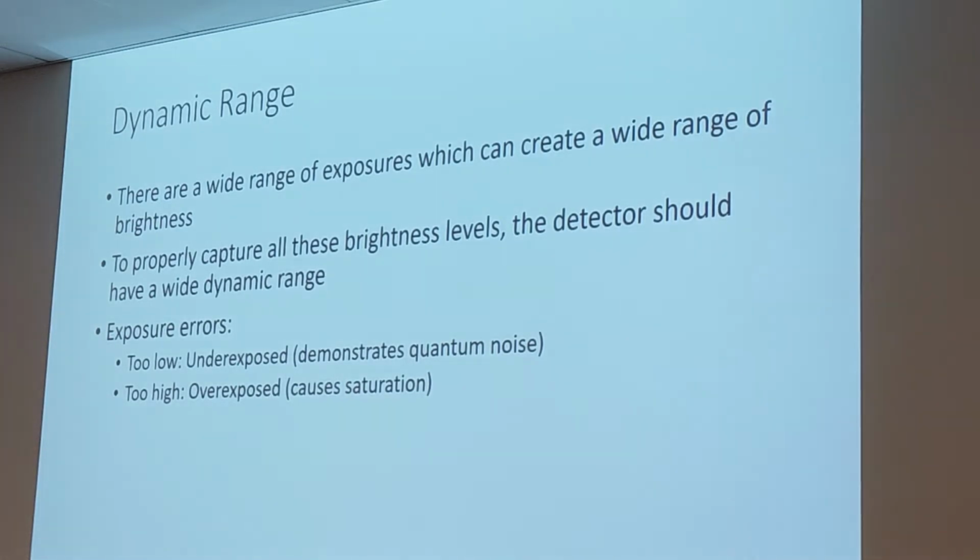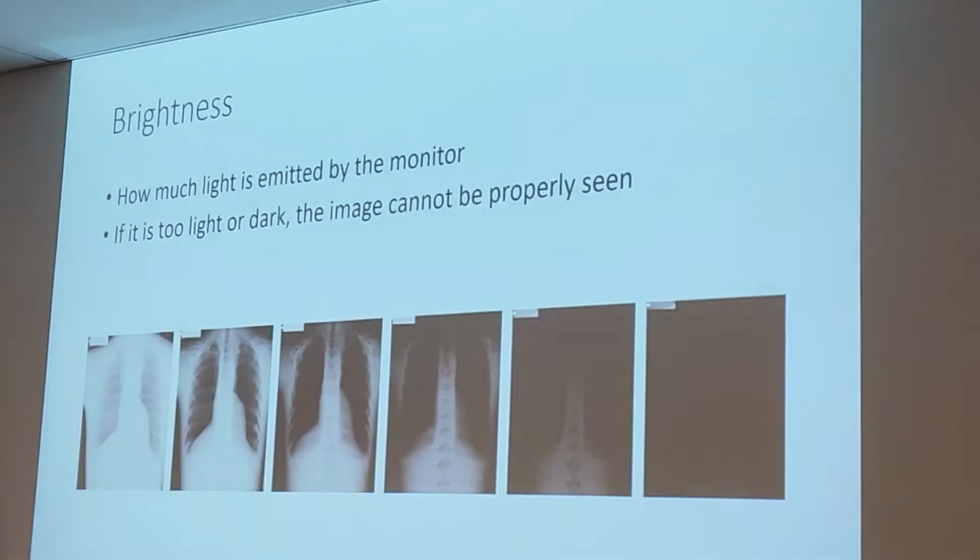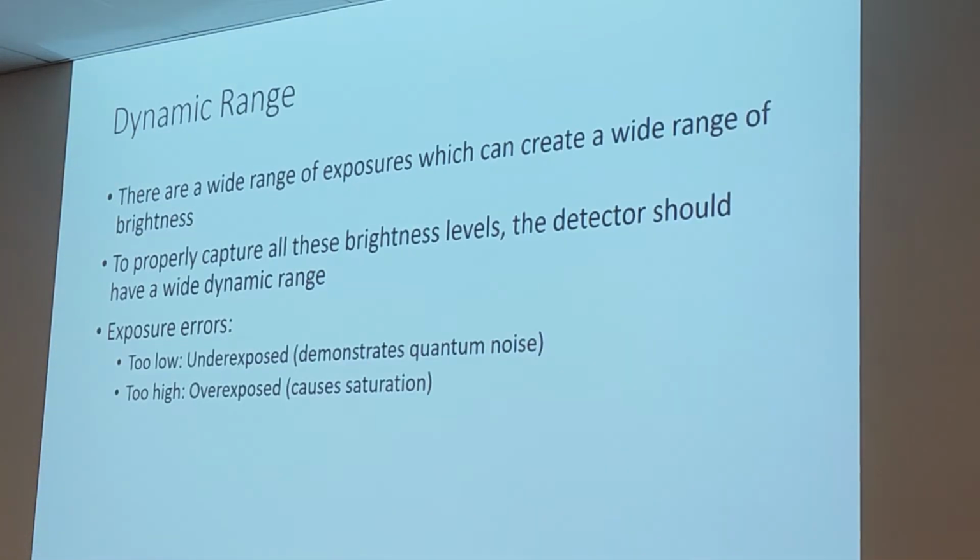But the wall AEC is like, well, it's not my job. You turn on the table AEC, so it's its job to wait for X-rays. Are you shooting any X-rays at the table? No. Is the table AEC going to ever get enough X-rays? No. So what's going to happen? It's going to have a really long exposure time, and you are going to overexpose your patient. And it's just going to look black. It's going to look like that at the end. Right? So be careful. Be careful with your equipment. Know how to use it properly.